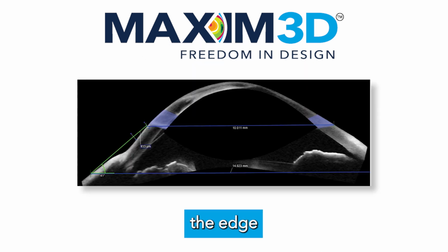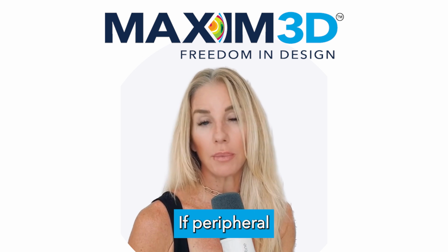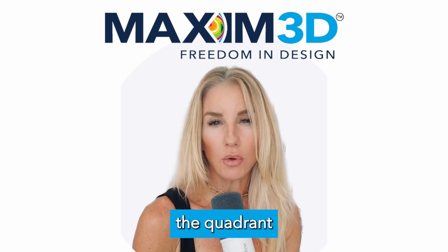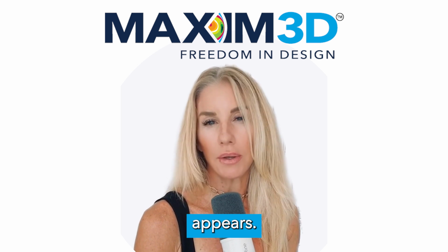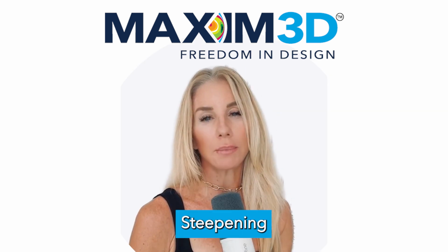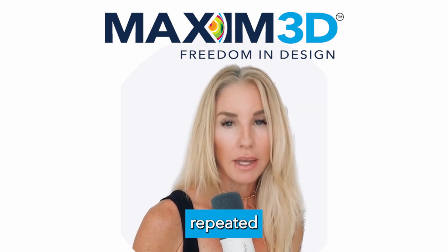Next, steepen the edge or landing zone. If peripheral bubbles persist, steepen the PC4 or landing zone in the quadrant where the issue appears. Use toric, quadrant-specific or free-form landing options in Maxim 3D to refine edge seal precisely. Steepening closes the gap and prevents repeated air entry.